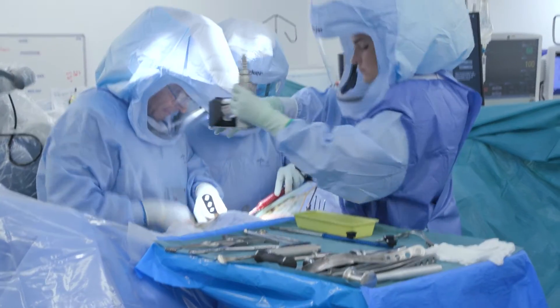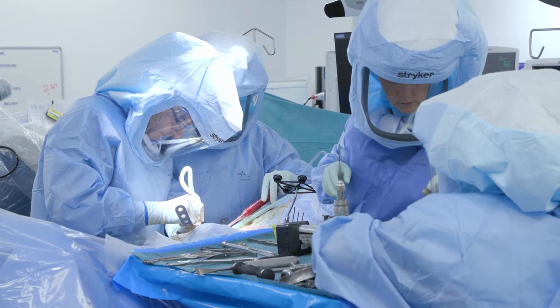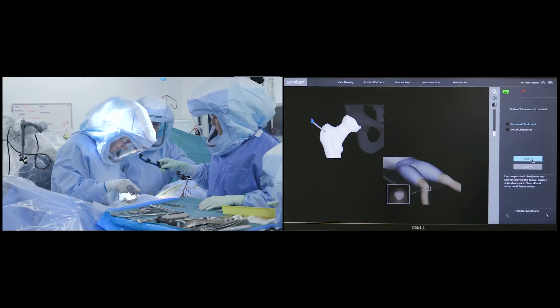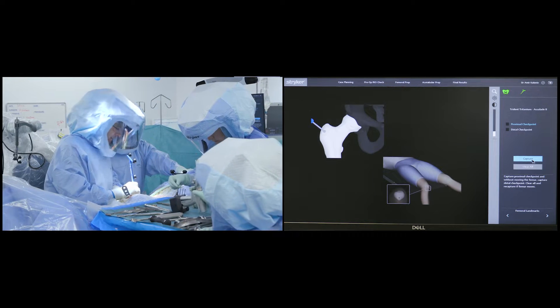A femoral marker is placed on the proximal femur, which will assist in measuring later changes in femoral length and offset. A baseline measurement of the patient's femoral length and offset is then made prior to cutting the femoral neck.